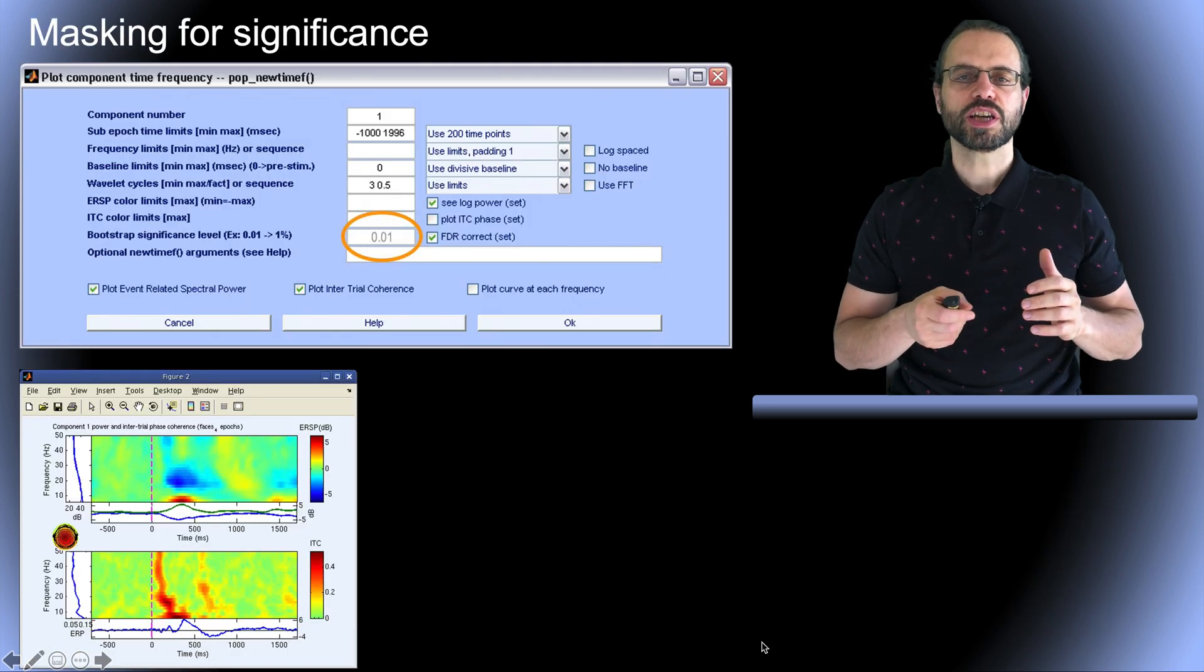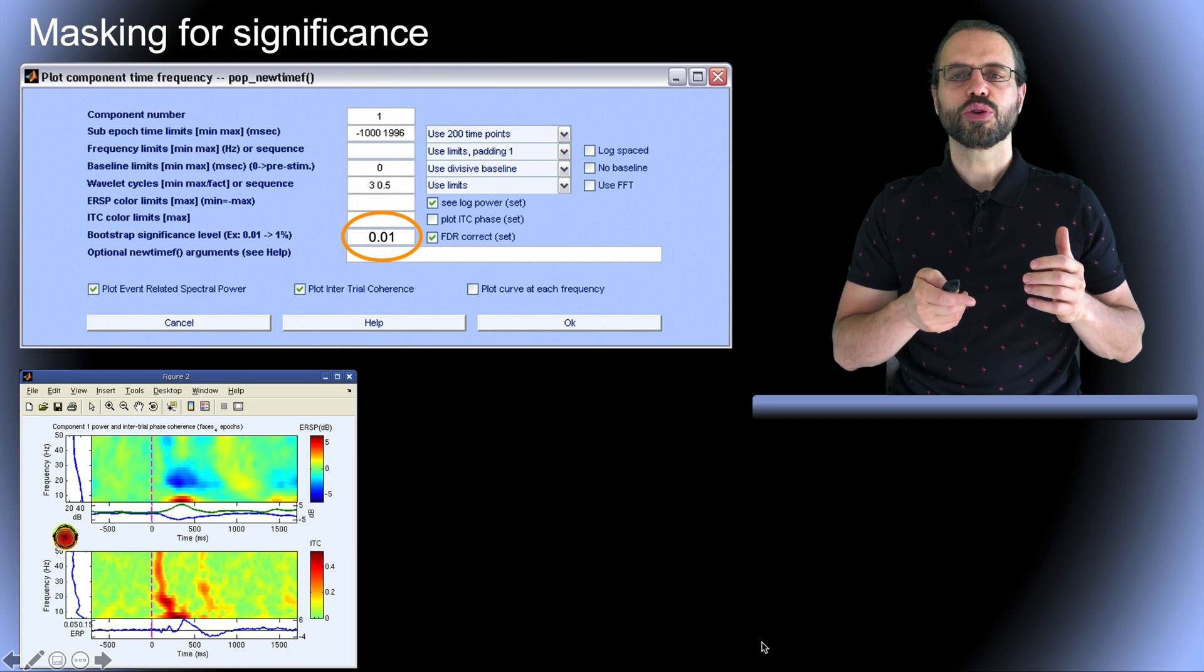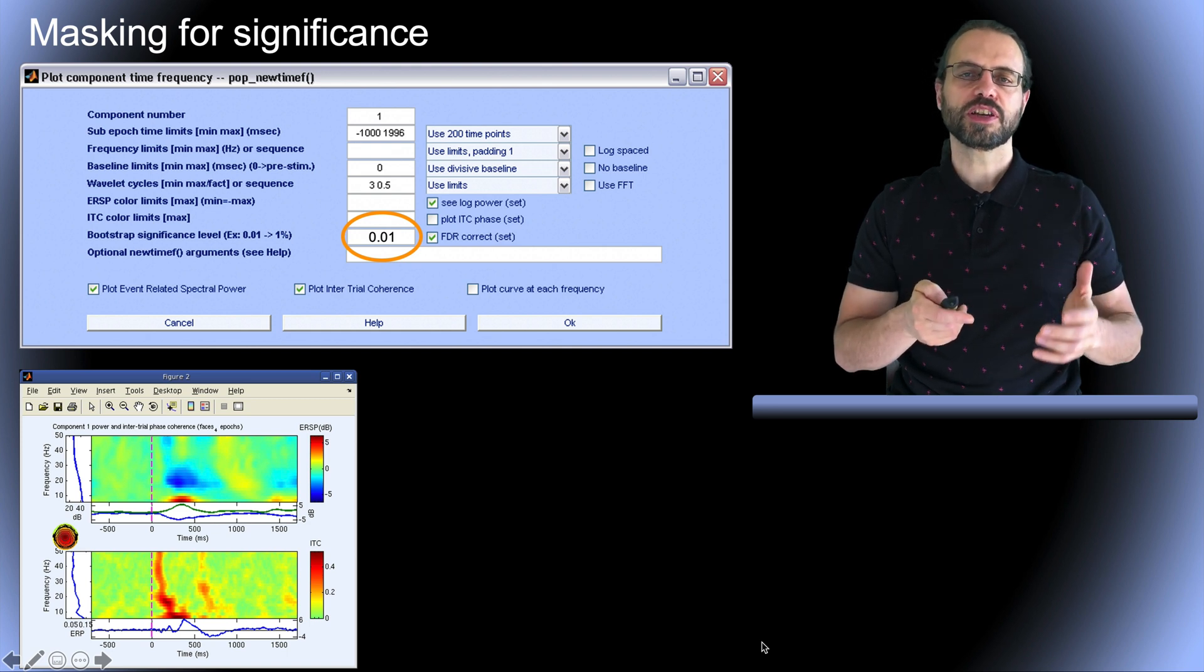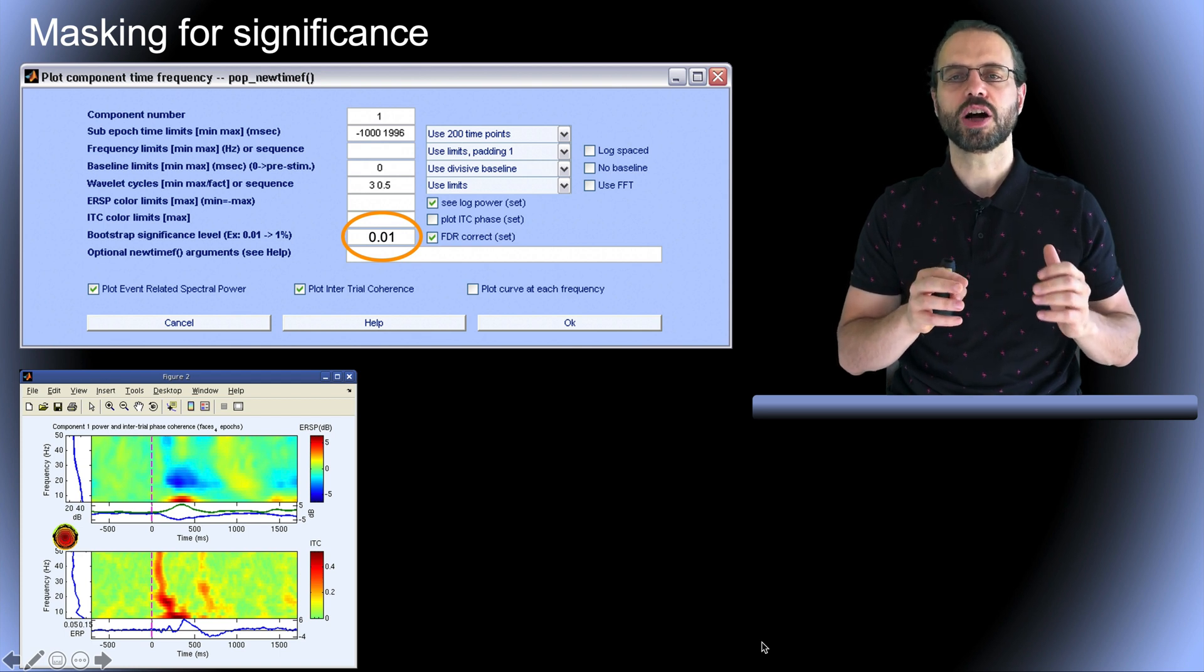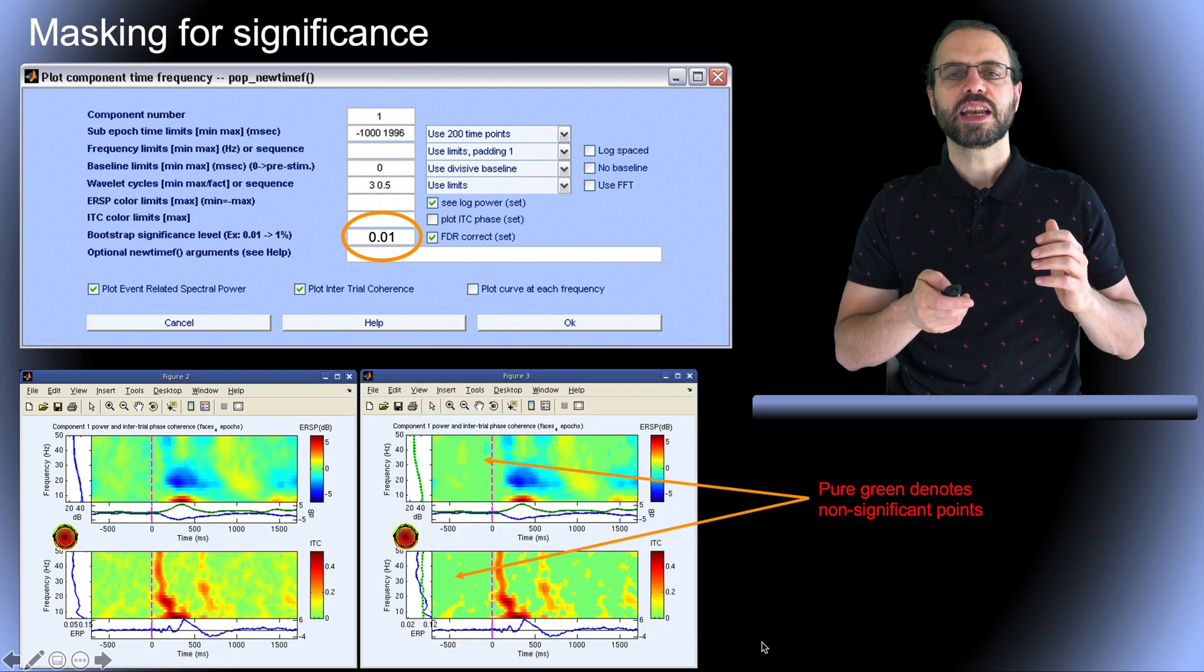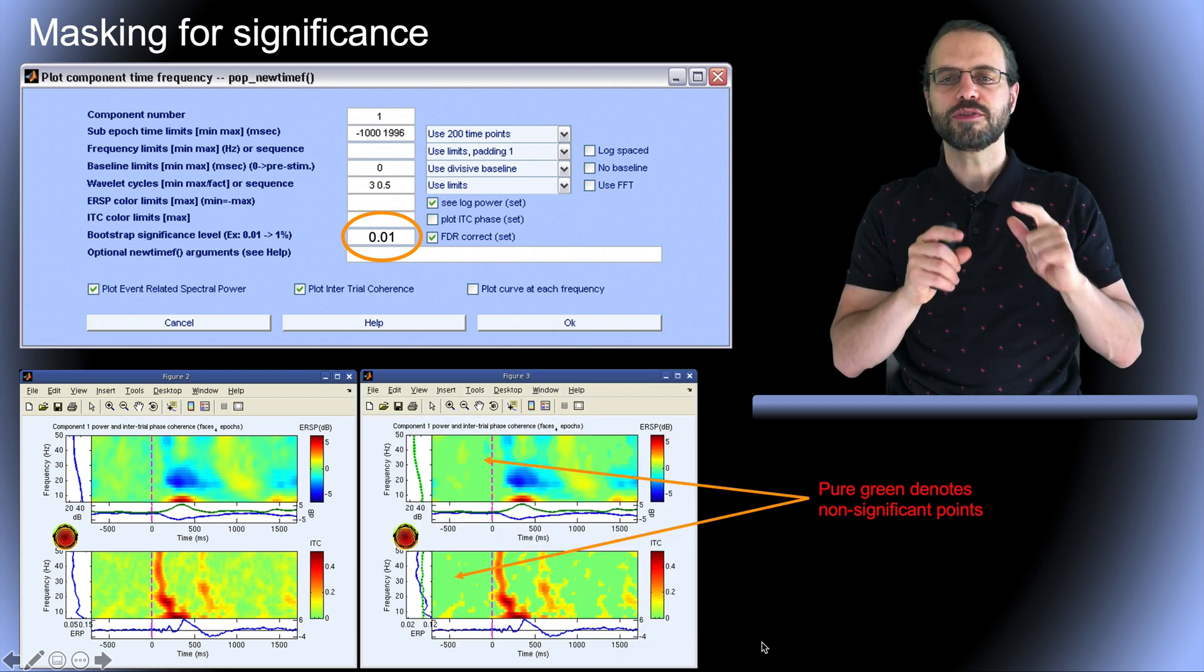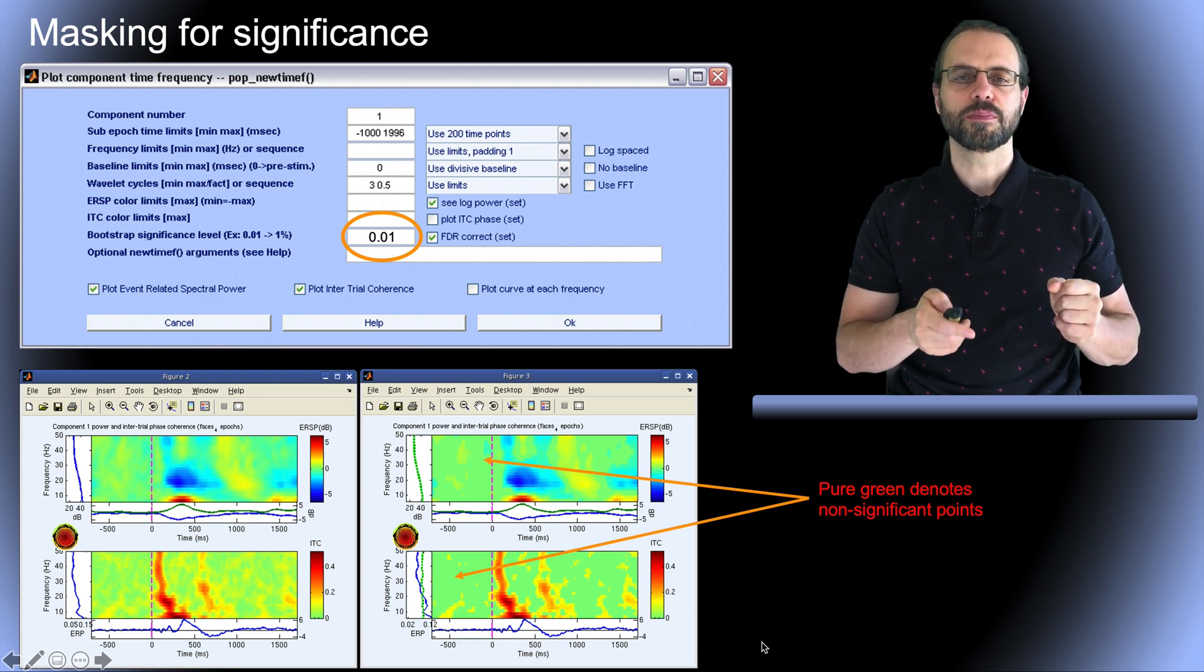You can choose to mask for significance, here at 0.01. Note that if you mask for significance, I strongly advise that you correct for multiple comparisons by checking the FDR checkbox on the same row. This is the plot you obtain, and now the pure green color indicates time frequency regions where the spectral estimate is not significant.